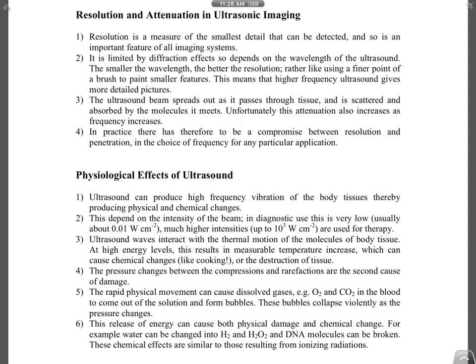Now, unfortunately, the higher the frequency of the ultrasound, even though it gives you better resolution, the side effect is it tends to be absorbed more by your body. The higher the frequency, the more will be absorbed. That means the higher the attenuation, which is the decrease in intensity. So as it passes through your body, more ultrasound is absorbed.